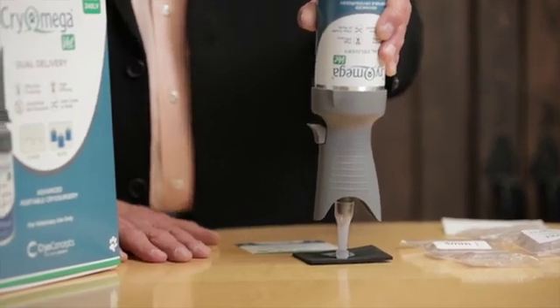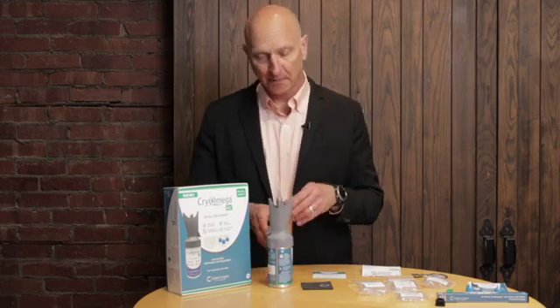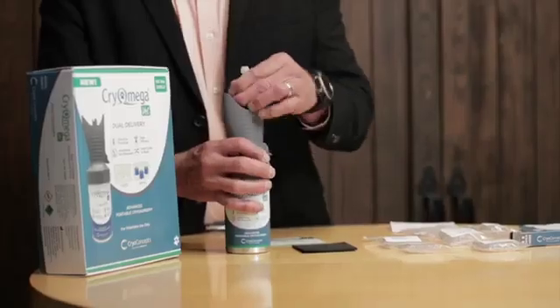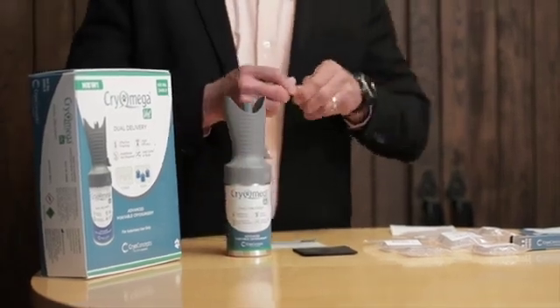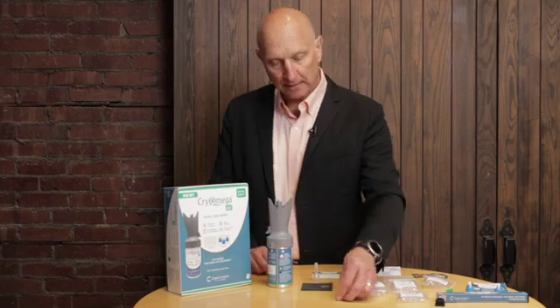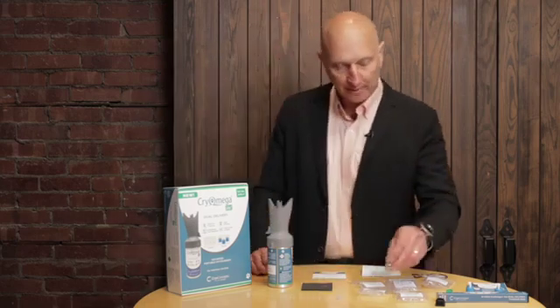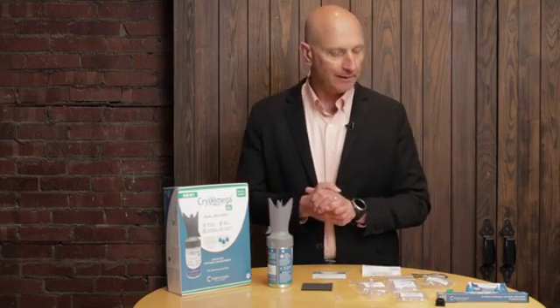The canister itself will give about 200 treatments, 200 5-second treatments, and when you're done doing the cone treatment, you remove the applicator. Okay. And the 5 millimeter applicator may be disposed of. The adapter is kept with the kit, and that's simply how you do a cone treatment.